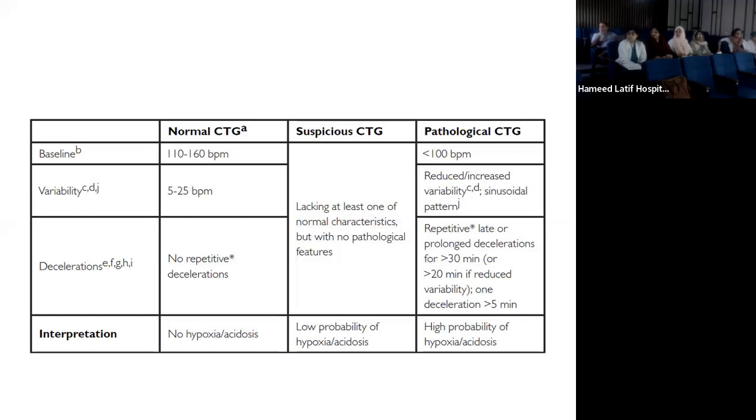So why can't we use Cusco's? Why that long tube, why can't we make it simpler? Because you need better visibility and you need something which actually stays inside for a while, because it's not a small thing to do. With the Cusco's, she'll move and it will immediately go outside.